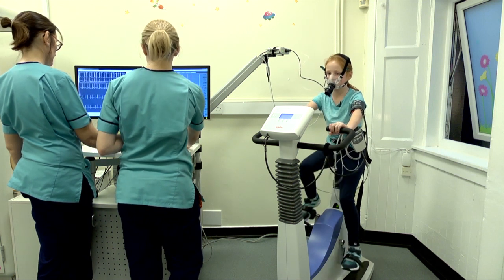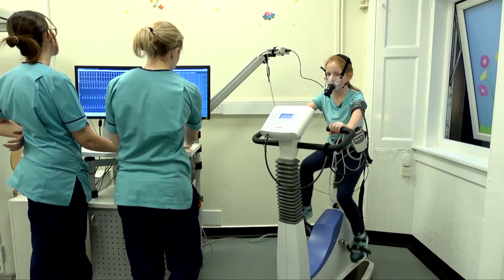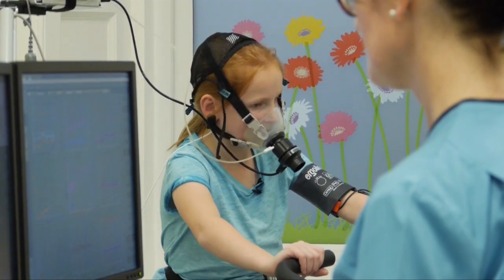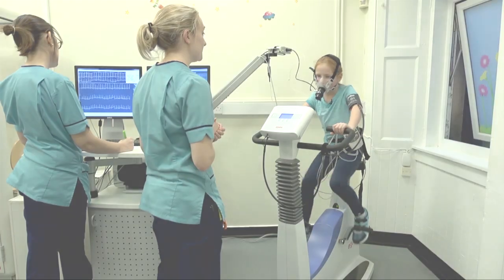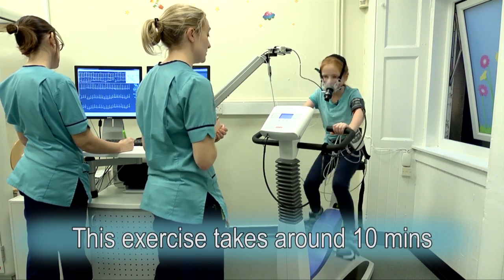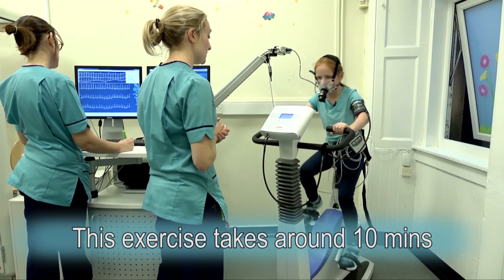So what we're going to do now is go into the exercise phase. You just keep pedalling like that. It's going to get harder and harder to turn those pedals. That's perfect — just stay in that rhythm. Keep it nice and steady. Keep pushing.